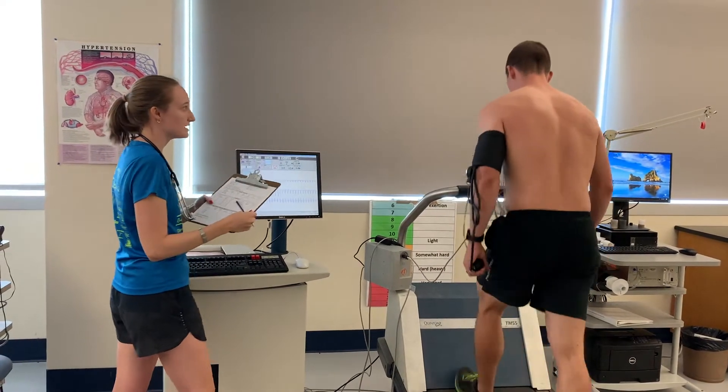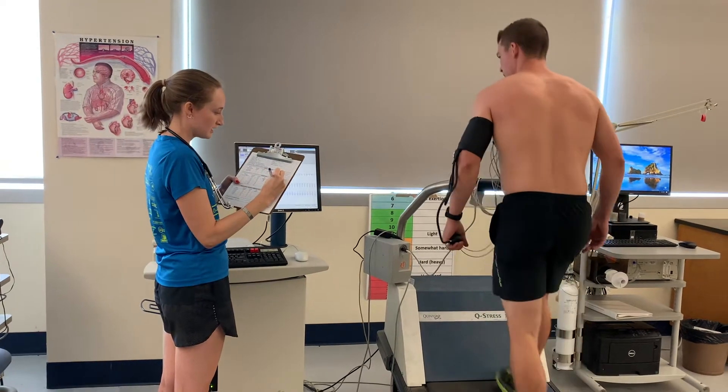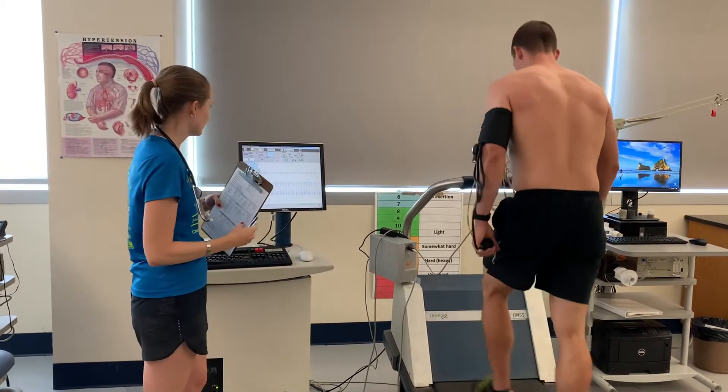What is your RPE? You're going to go up to the next stage in about five seconds. Doing really good.